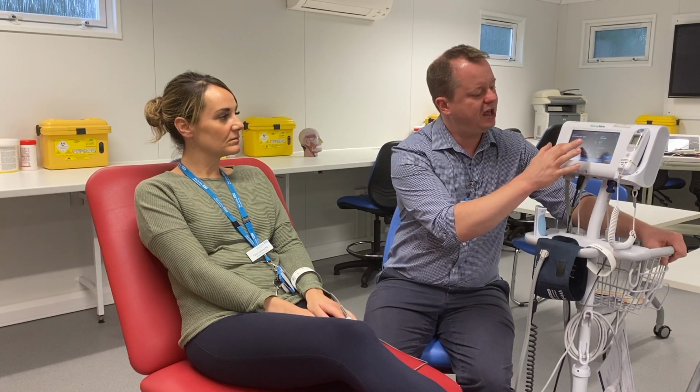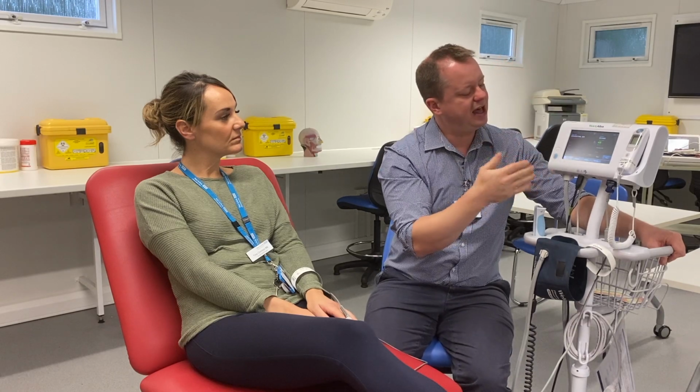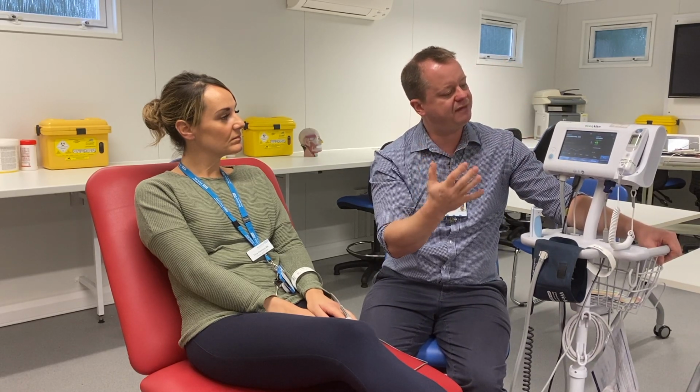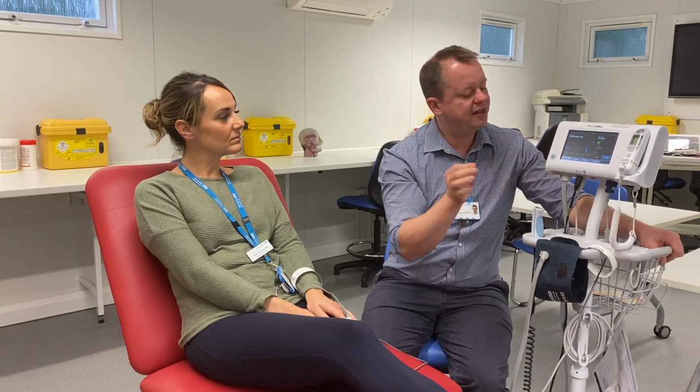She's very healthy. You can alter the machine to look at the waveform that the pulse is creating, and you can see that's a really healthy waveform there. So we're really happy with what we're recording. We know it's accurate, and then we can write that down.